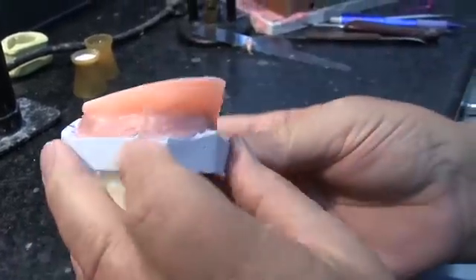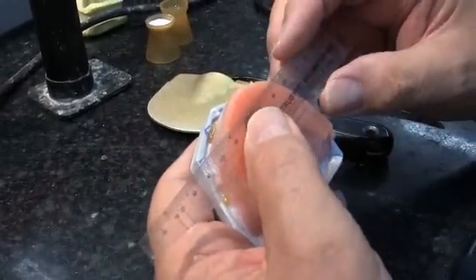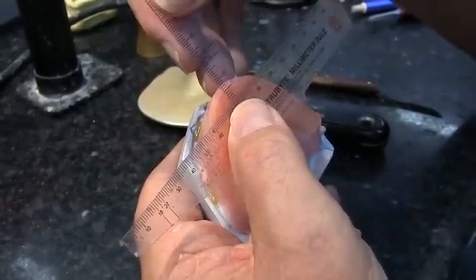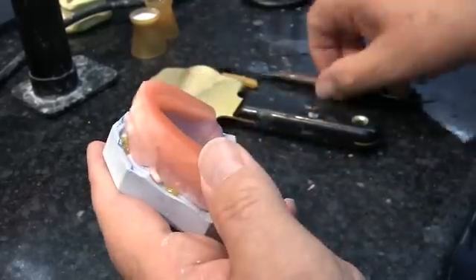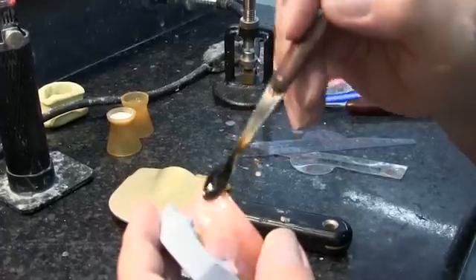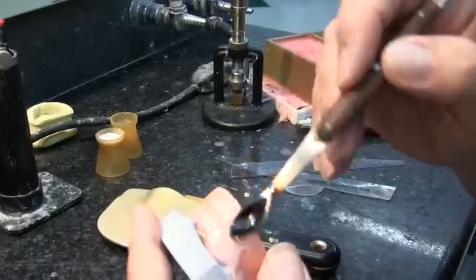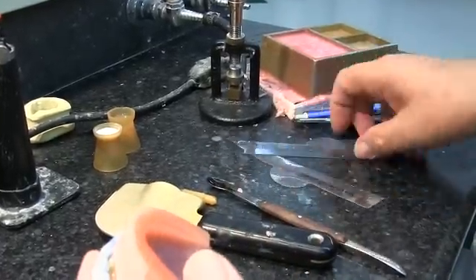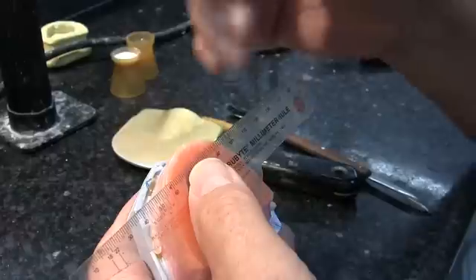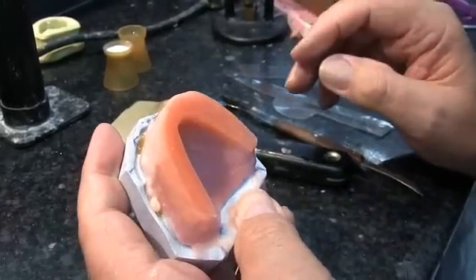Now it's nice and level and smooth. We're checking to make sure that the labial aspect is approximately 6 millimeters anterior to the middle of the incisive papilla, using the landmarks we marked on the cast. That was a little bit over, so we're going to remove some wax to cut it back and let that wax run down towards the periphery to begin blending in the occlusion rim. I think we're pretty close to 6 millimeters, so we're going to leave that.